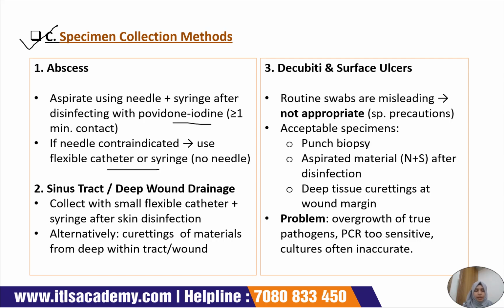For sinus tract and deep wound drainage, the specimen must be collected with a small flexible catheter with syringe after the skin is disinfected. The alternative method is curettings of materials from deep within the tract or wounds.